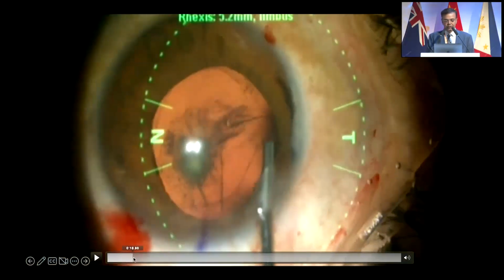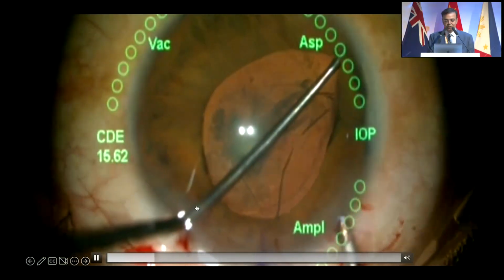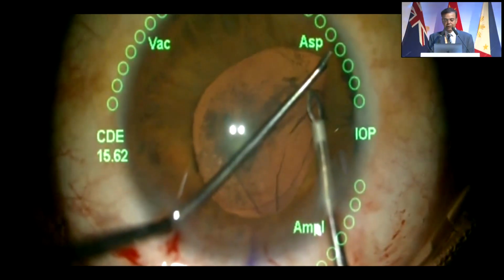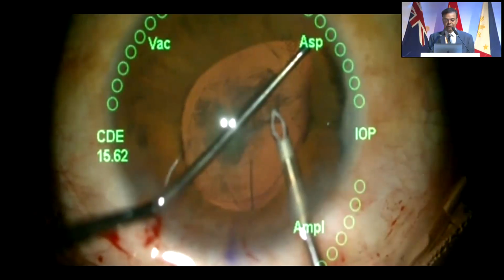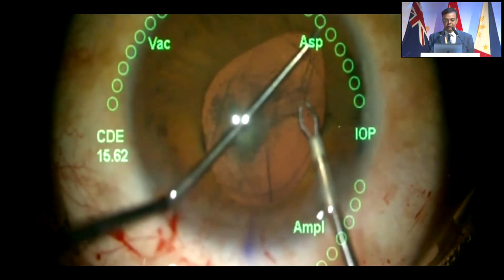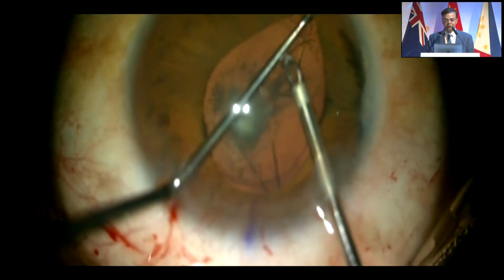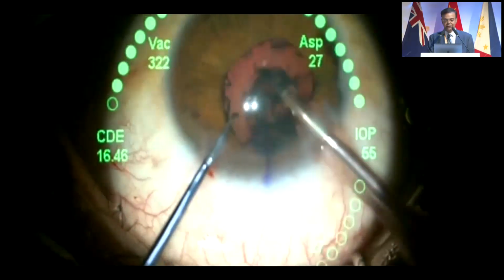So going ahead with the cataract removal, we have been using this. The rhexis tended to run out a little bit, so you can see that I'm just moving it to one side and doing the Brian Little's maneuver to bring that rhexis back under viscoat cover. So there I'm going to pull in the counterintuitive direction and the rhexis will be recovered over there. And you can see that I'm able to bring it in and then recover the rhexis. So in these cases where you don't want all these things to happen, they tend to happen. So I was able to anyway recover that. And then of course the cataract surgery itself was fairly uneventful.